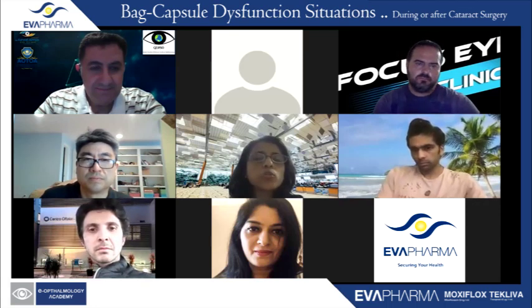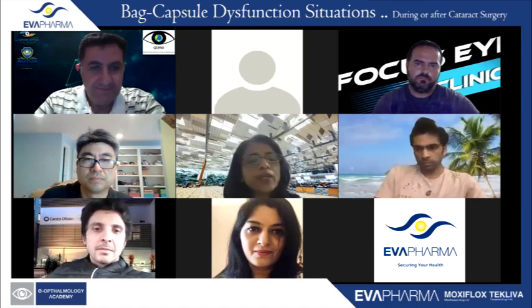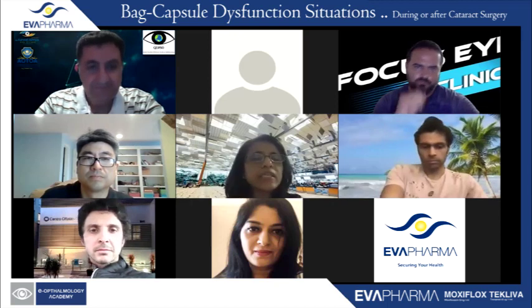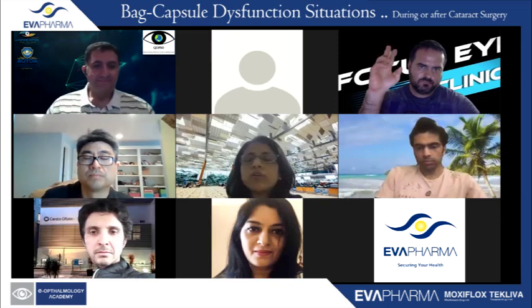The second thing you can also do is to put a capsular tension ring into that empty bag so that you don't get phimosis as such, and then optic capture that IOL. So that's the second thing that you could also do. So these are basically options that you can exercise in such cases.